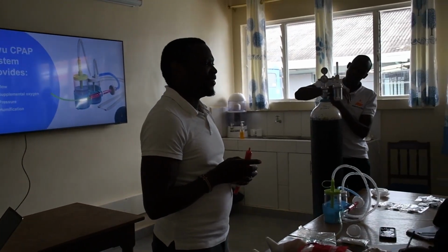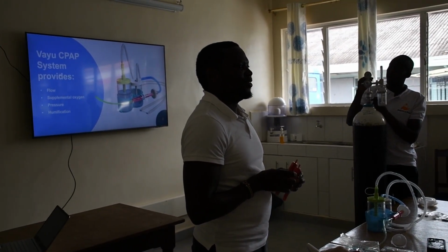Pumwani, the America, Fisher Paykel. So please call ours by its name, don't call it bubble CPAP. Don't jump into the others.